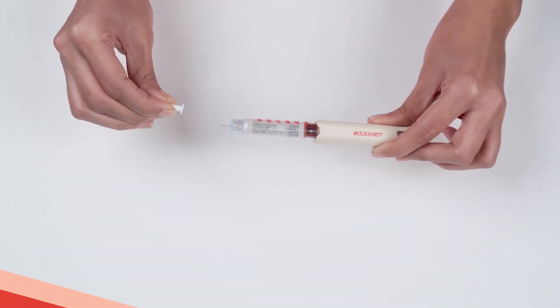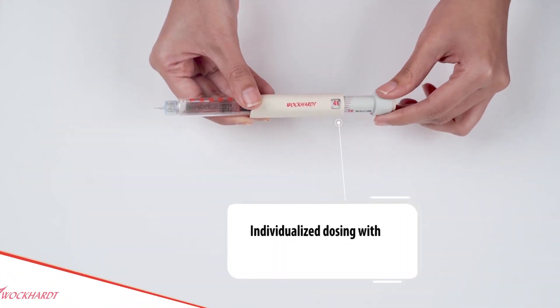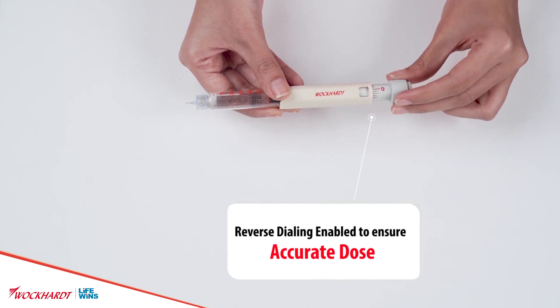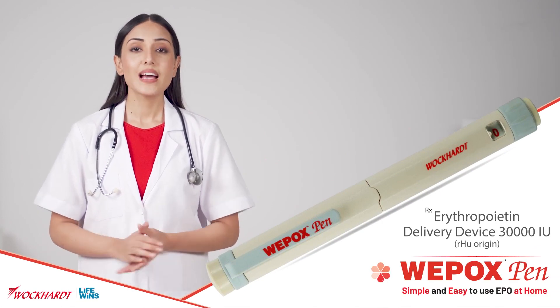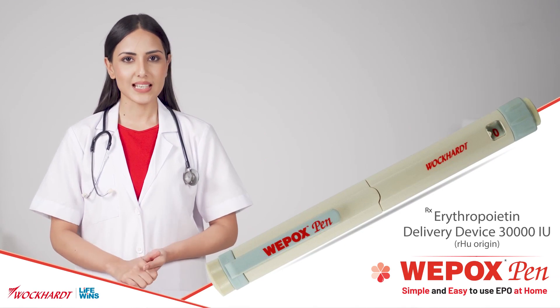Specially engineered needle that is 32 gauge, 4mm, 5 bevel needle for subcutaneous administration. Individualized dosing with a large window for clear reading. Reverse dialing is enabled to ensure accurate dose as prescribed by doctor to the patient. Wepox Pen 30,000 IU can deliver doses from 100 IU to 6000 IU.